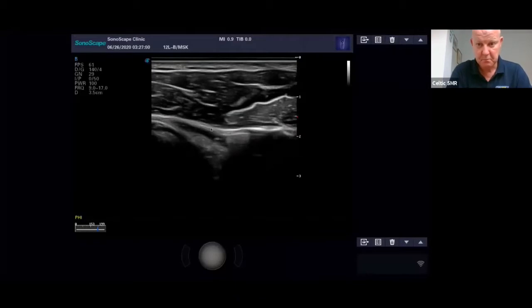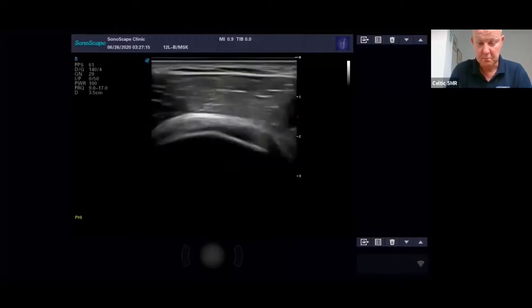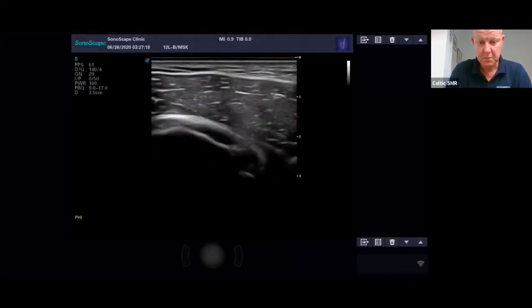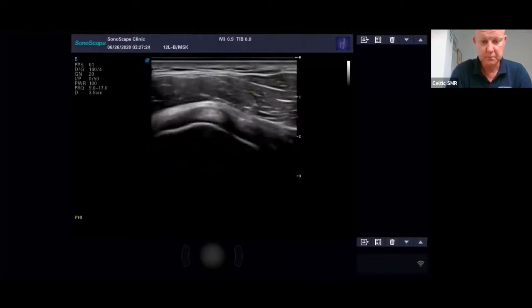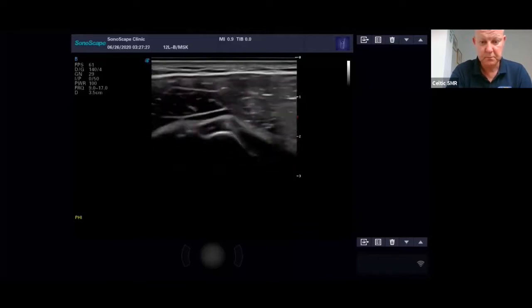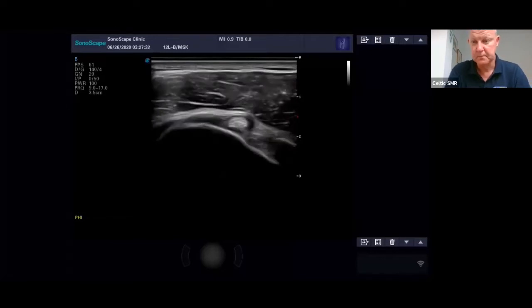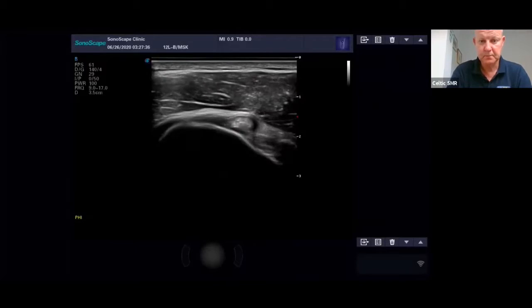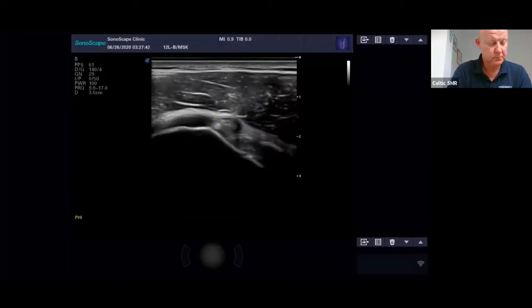It's all right. So this along here is the coracohumeral ligament. If it looks thickened, and sometimes you can get some fluid around here, that can be indicative of a bit of a frozen shoulder, and also the rotator interval, which is a bit higher up. Probably best to see the rotator interval from up here, just where it dives into the intra-articular portion here, which you can put the colour Doppler on. I must admit I've not seen it too often, but literature suggests that it can be an indirect sign, so it's something to look out for.